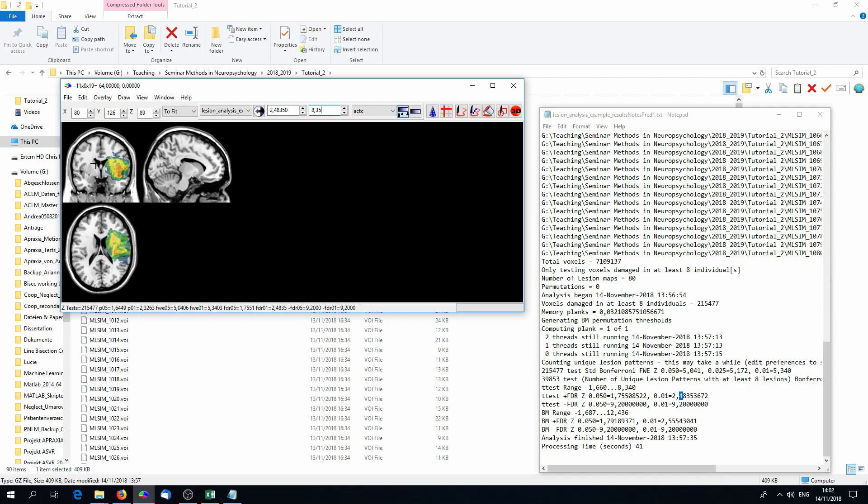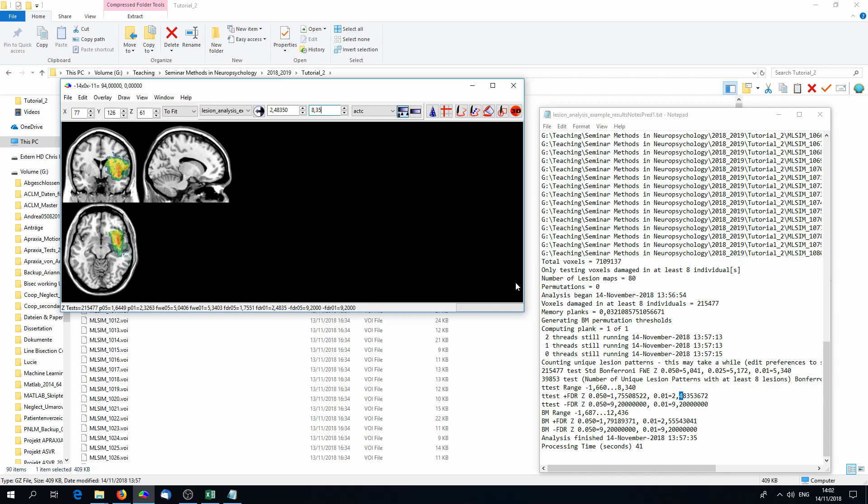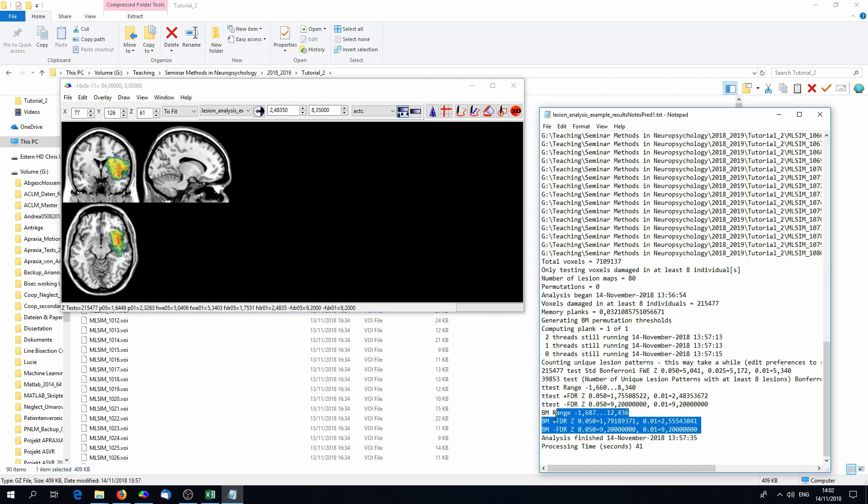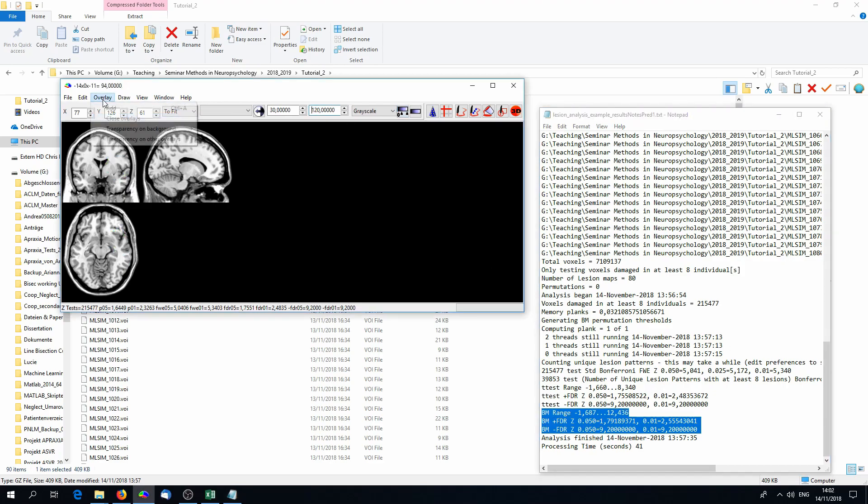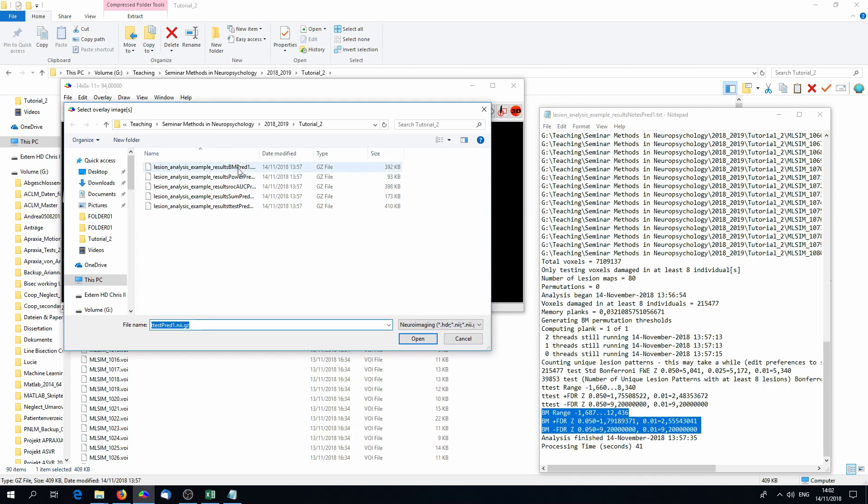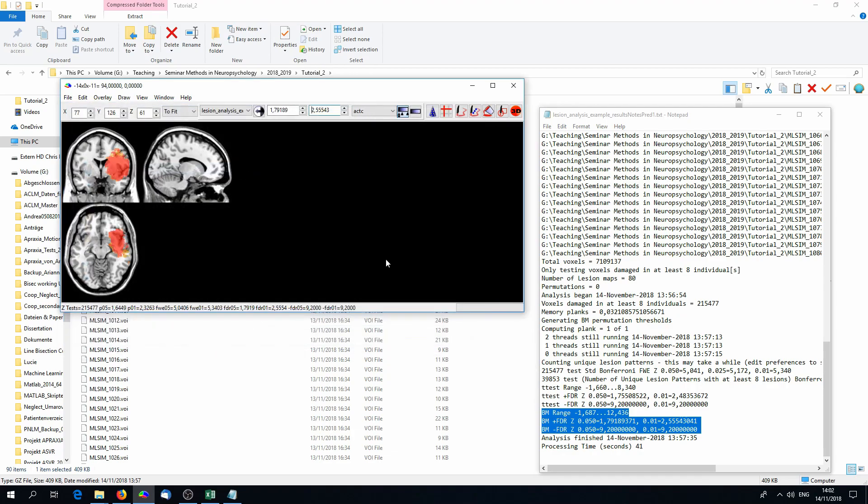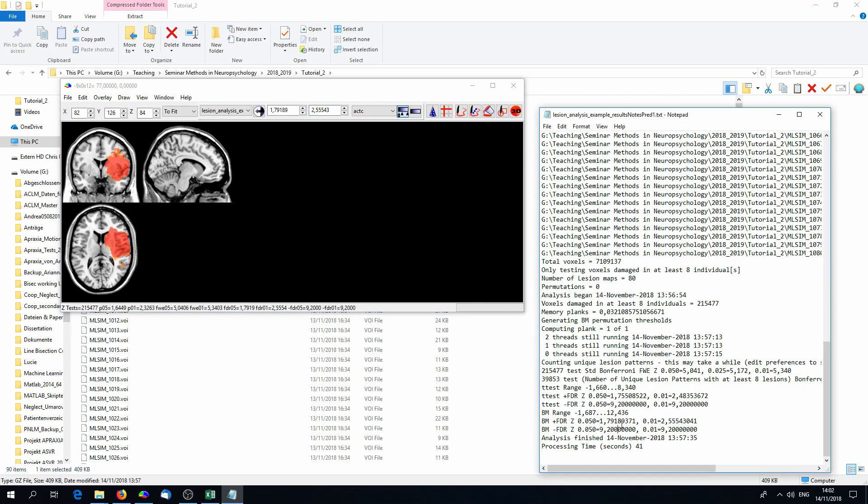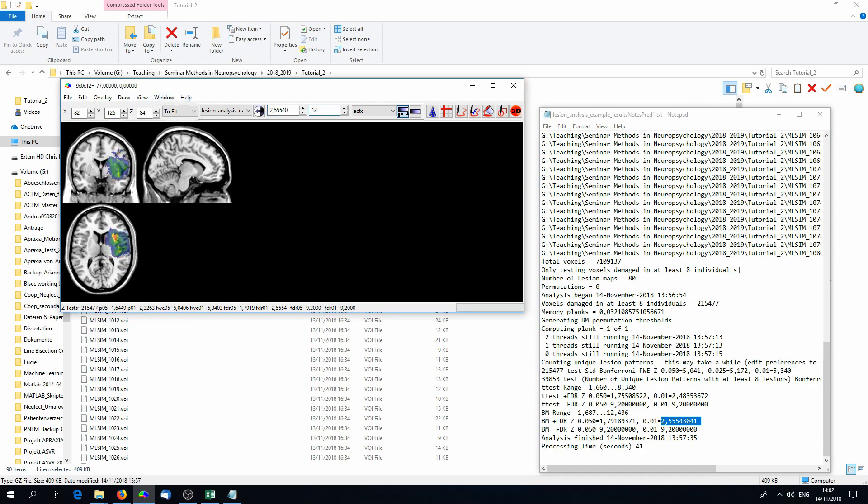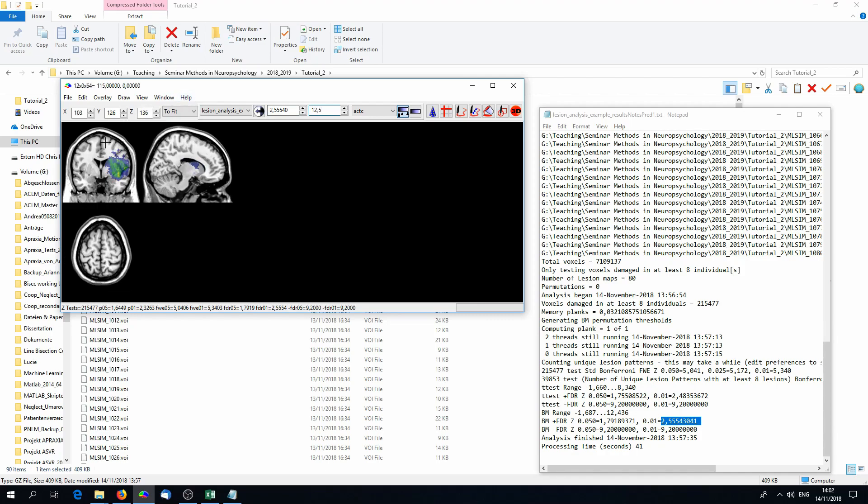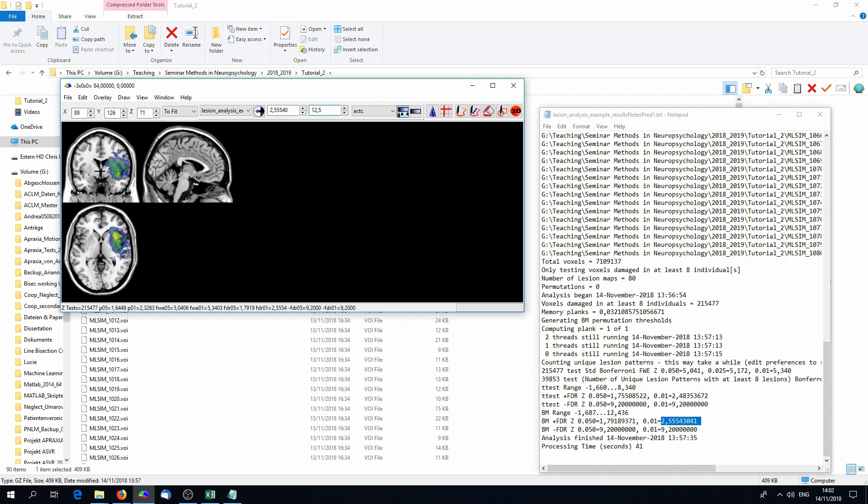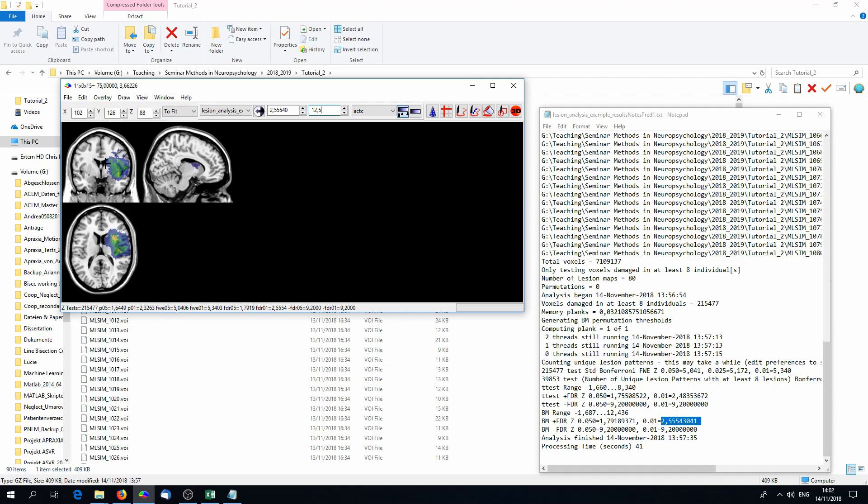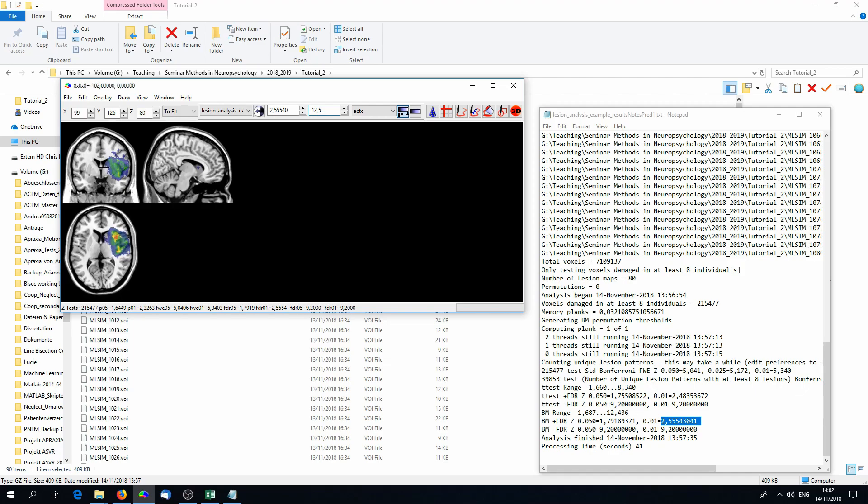You might remember we did not only a t-test but also a Brunner-Munsel test. You'll find information about the Brunner-Munsel test also in the text file and you have the image available. Open the image on a template and again we have to rescale the image. First, you might realize that there is no family-wise error correction result. Again, no significant results left but FDR. Go into the upper left panel for the rescaling and put in the cutoff and on the right you put in the maximum value that you can also see in the text file. And again, we have a collection of voxels that are shown in color and these are significantly associated with the symptom.